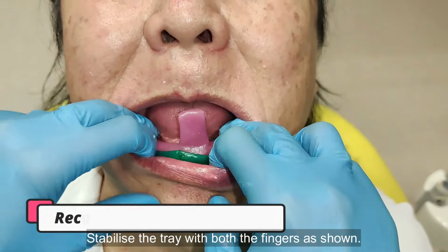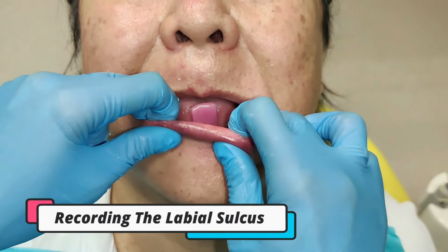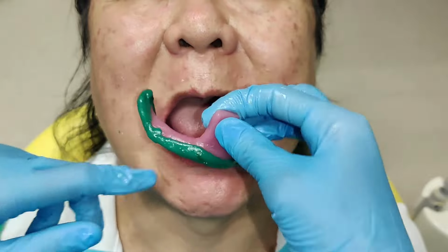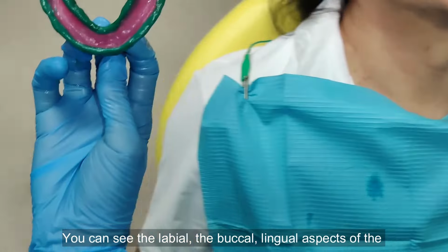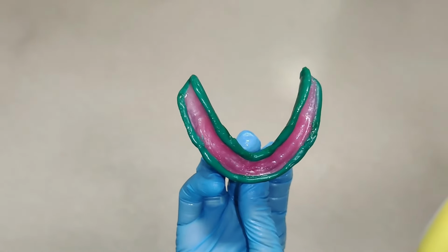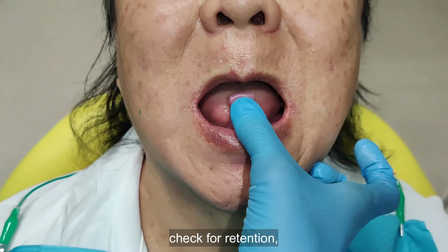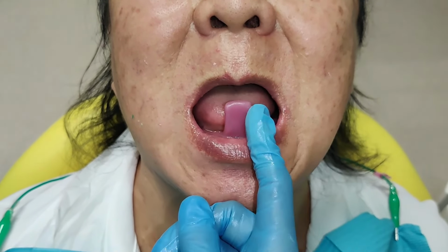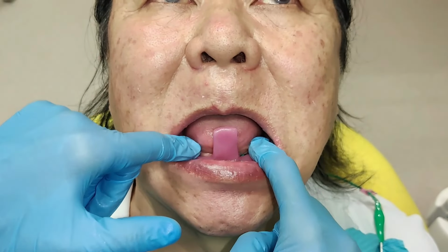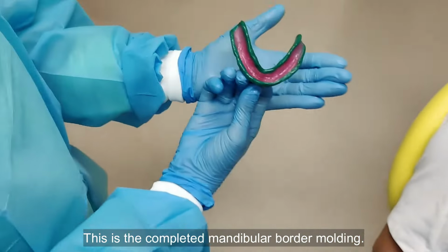Stabilize the tray with both the fingers as shown. Use the thumb and index finger to perform the labial movements. You can see the labial, the buccal, lingual aspects of the border molding completed. Before proceeding with the final impression, check for retention, stability and support. This is the completed mandibular border molding.